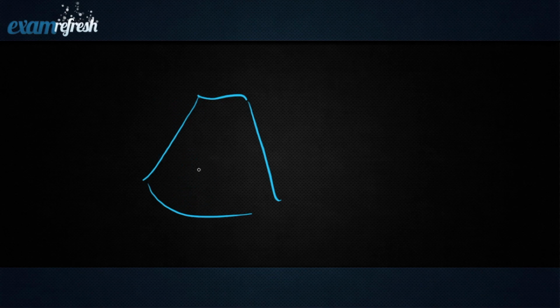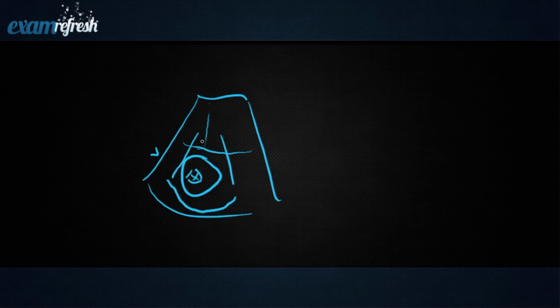The other thing would be, again, if we're imaging this little heart here, we have 1 focal zone, we decrease our depth, but all of this information here is extraneous as well. So what you can do is mag up on this, so you zoom in where you have all the information you need, and that's it.